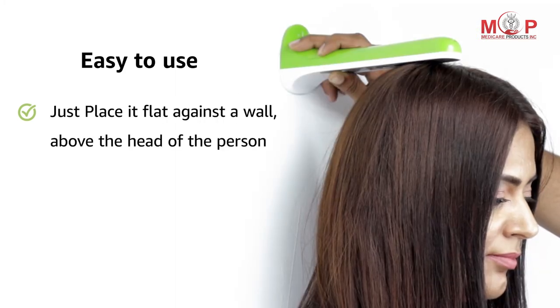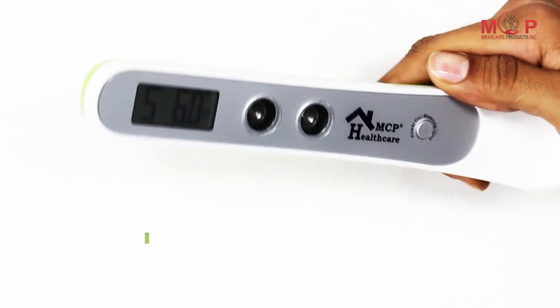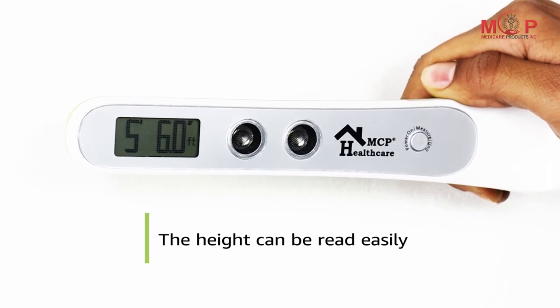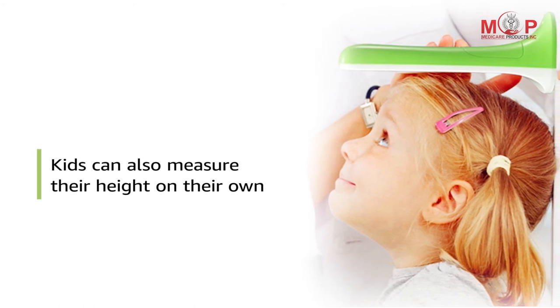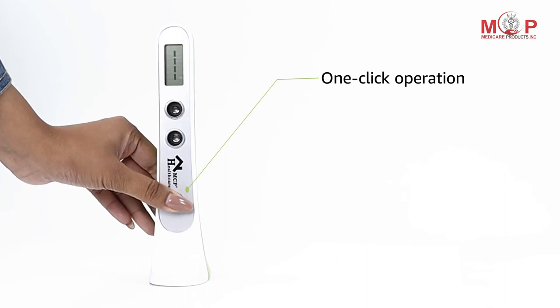Just place it flat against the wall, above the head of the person. Once it is stable, the accurate height measurement can be read easily on the LCD screen. Kids can also measure their heights as this ultrasonic stadiometer from MCP is very easy to use with one-touch operation.